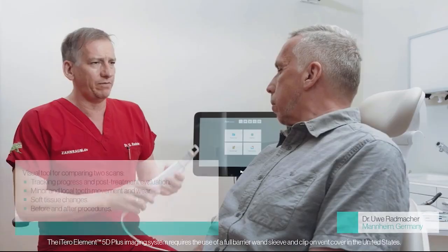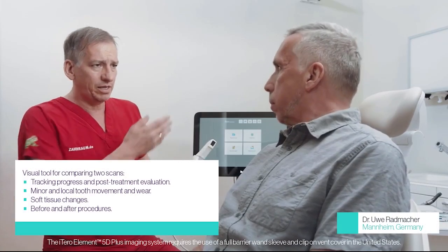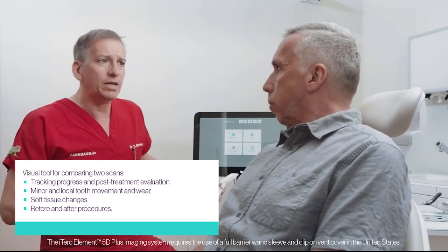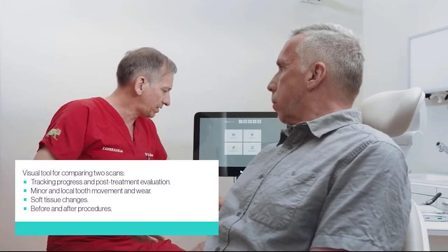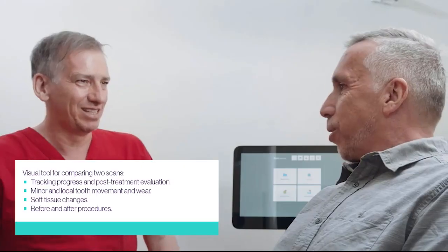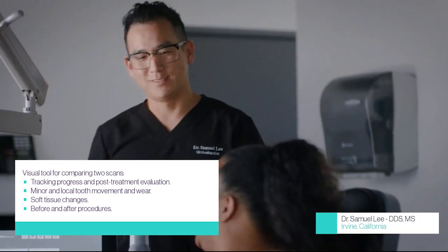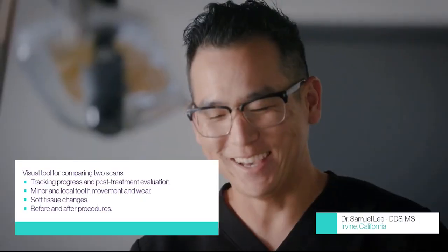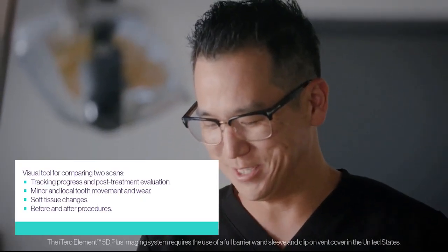The iTero time-lapse technology is a powerful visual tool for comparing two scans from different periods of time and detecting differences between scans. It can be used to compare the baseline pre-treatment scan with progress and post-treatment evaluation scans.